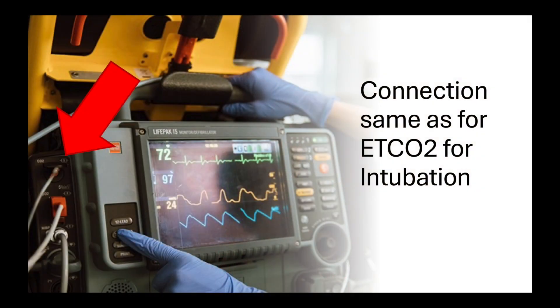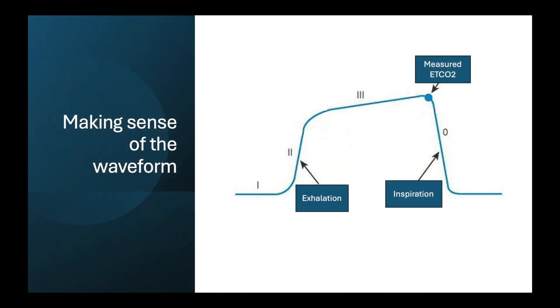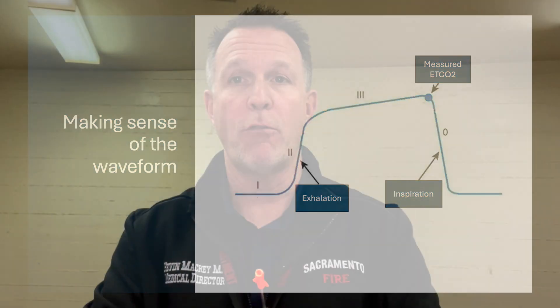For this thing to function for End-Tidal CO2, you only need the CO2 connector — it has the same connector we use for intubation currently. A quick reminder of what the waveform looks like: when the person breathes in, the waveform drops; as they exhale, it rises. The very first upstroke is them breathing out. At the end of exhalation, that's the End-Tidal CO2 — that blue dot we're measuring. As they breathe in, the waveform goes back down.